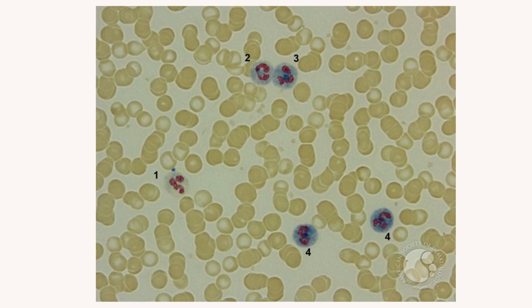Afterwards, when you are done staining, examine smears microscopically in the thin portion of the smear using the oil immersion objective. Count 100 consecutive neutrophils and band forms and grade each one from 0 to 4 plus on the basis of appearance, so the quantity and intensity of the precipitated dye in the cell.